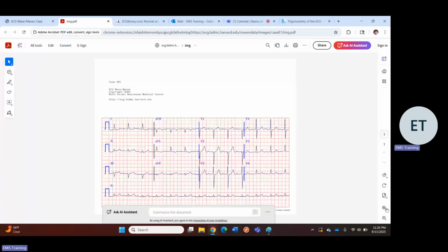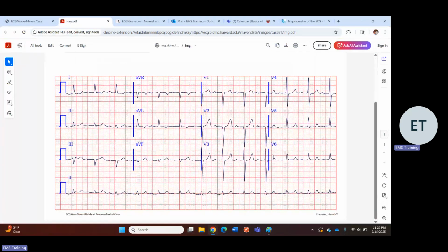Interesting. Okay. All right, does it look normal? No. Is there a P wave? Yeah. There it is. Very long PR interval, huh? They're everywhere. Weird. Okay. QRS doesn't look super wide.